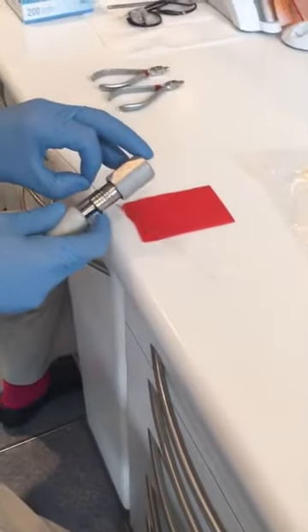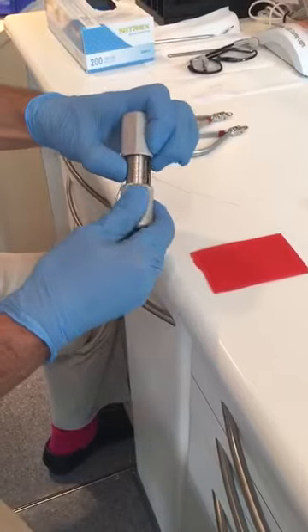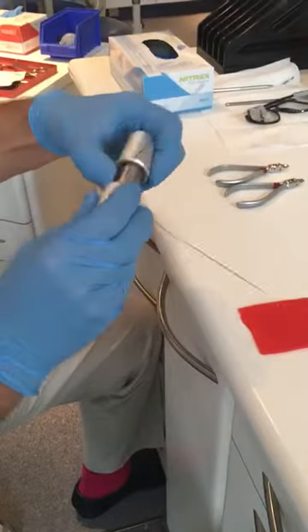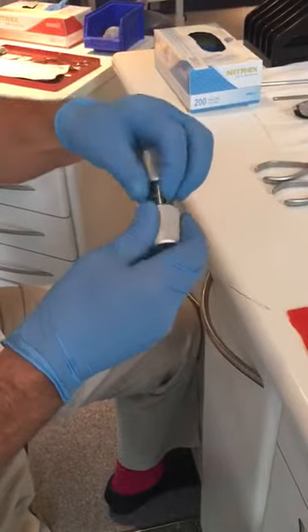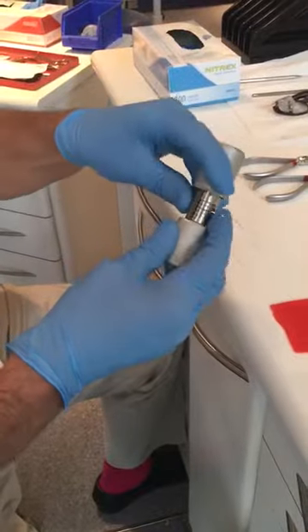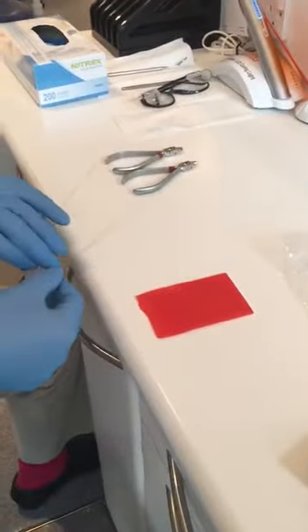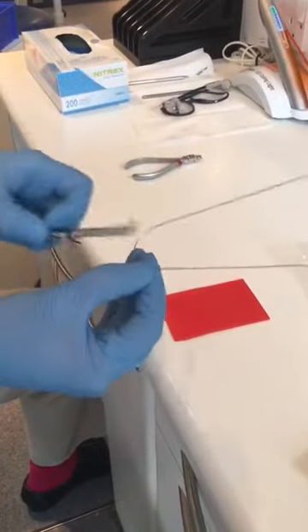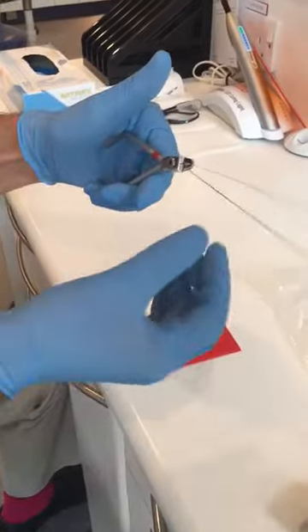So we get the straight length of wire and we put it in the 10-degree slot. Then you just hold your finger on the wire as you turn this round, just to get the anterior curve. And what that's doing is just putting 10 degrees of torque in the anterior section of the wire. So if you take the wire off now, you've still got a relatively flat wire. But can you see how you've got a little bit of torque?